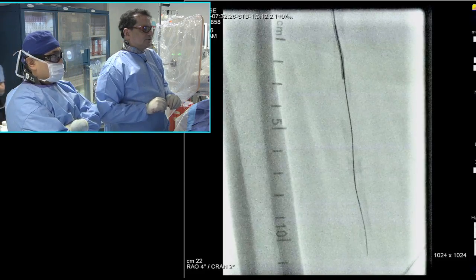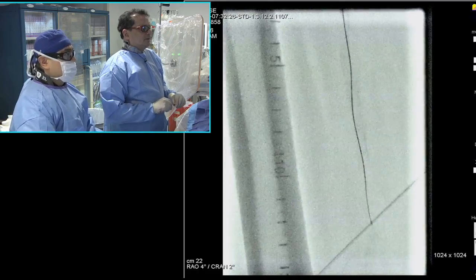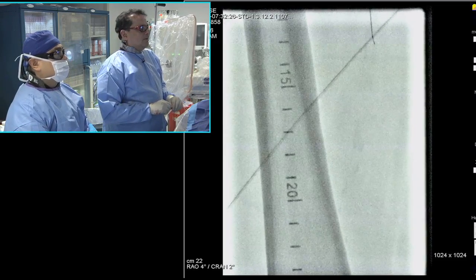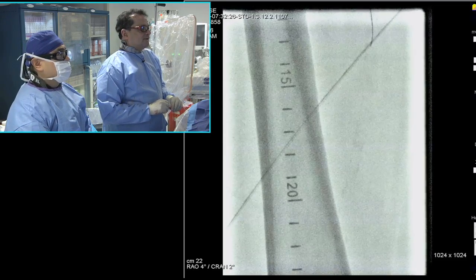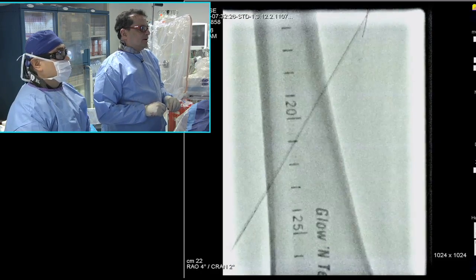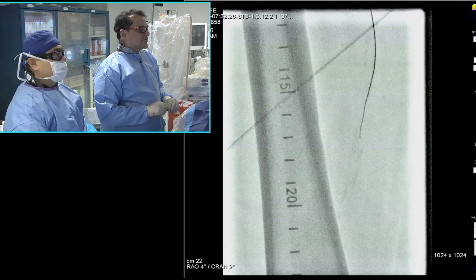See, now we're across the lesion. See that? Show me down, guys. See that? Now this is what I want to demonstrate because this is incredibly important. Because, you know, you're not that good. Nobody's that good. It's not that, oh, my God, I'm through and I'm showing off how good I am. That's not at all this. And you can see here we're still subintimal in certain areas.